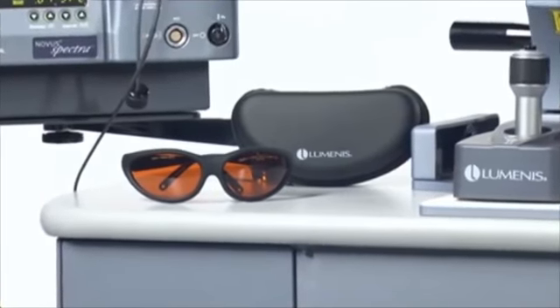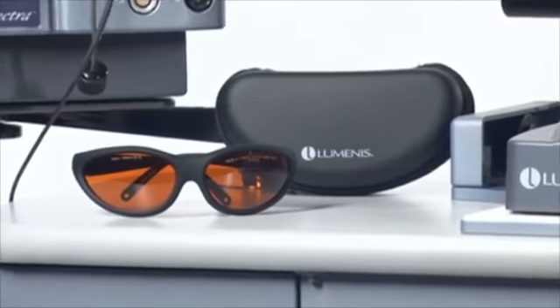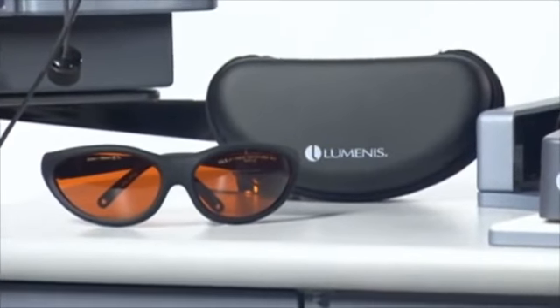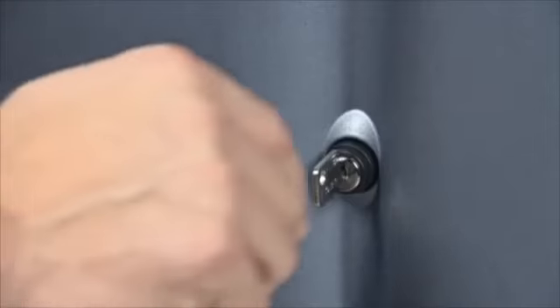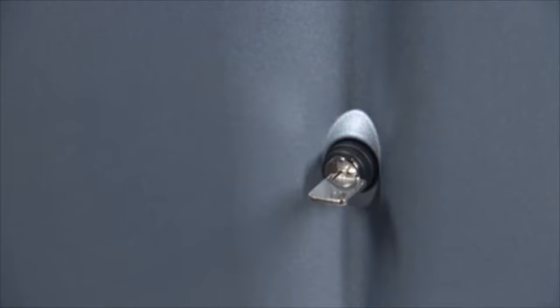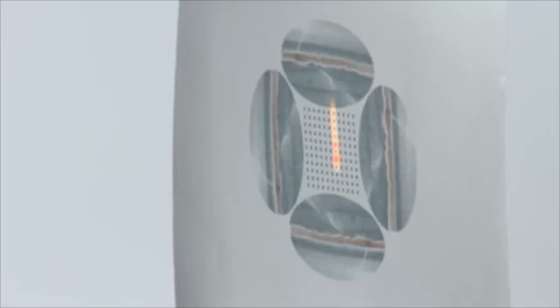Make sure that all persons in the treatment room are wearing the appropriate laser safety eyewear. See Laser Safety Eyewear in the Safety Regulatory Chapter for detailed laser safety eyewear information. Then, turn on the laser as instructed in the Laser Console Basics in this presentation, and verify the aiming beam as instructed in the appropriate delivery device operator manuals.